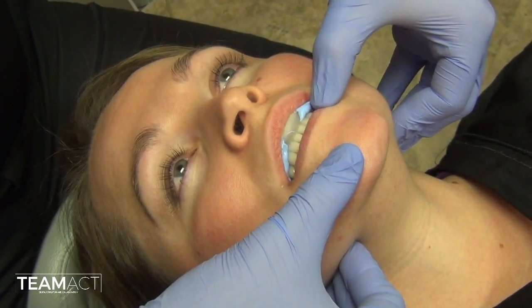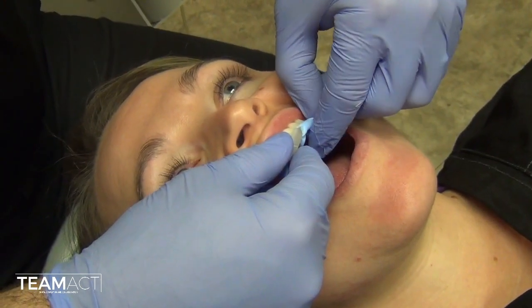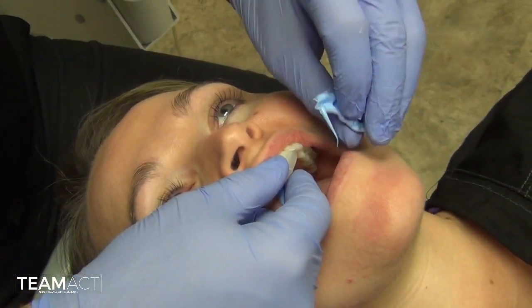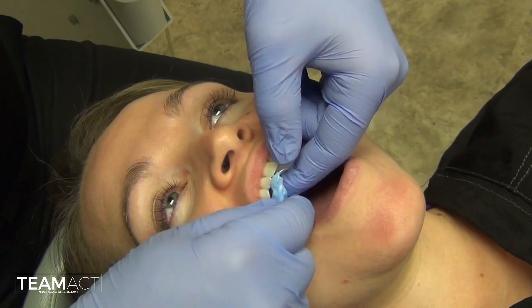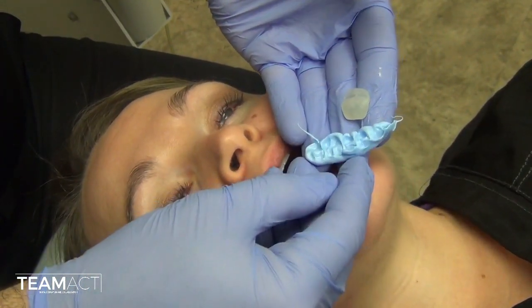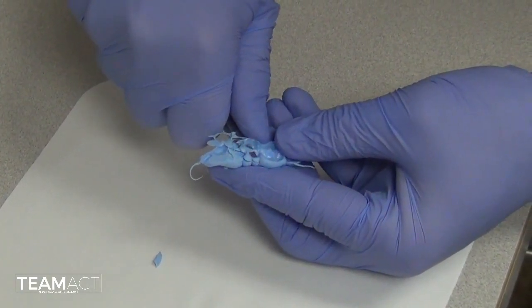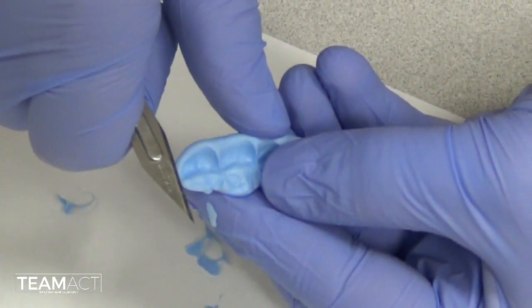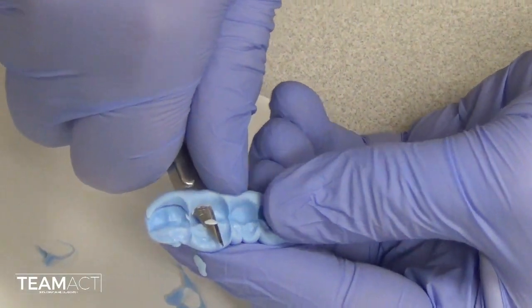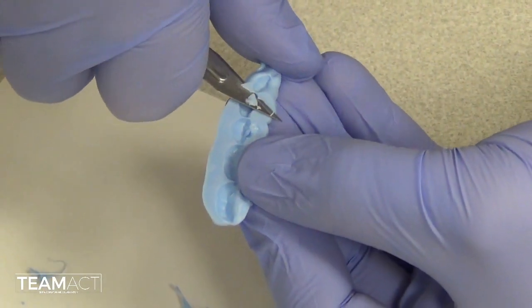Once it is set and firm, I will remove the records from her mouth and proceed to trim the records appropriately. Sometimes you can actually see where that CR first tooth contact is due to the thinness of the material in that area. When you trim the records, be very careful not to injure yourself. You will want to remove any occlusal groove anatomy as well as any interproximal anatomy. All you would like in the end is the cusp tips to be present to ensure that they best seat onto the models obtained from the impressions you made previously.